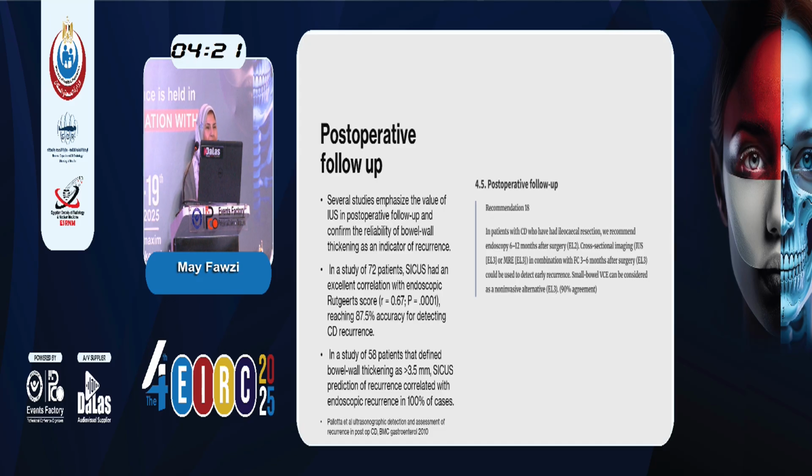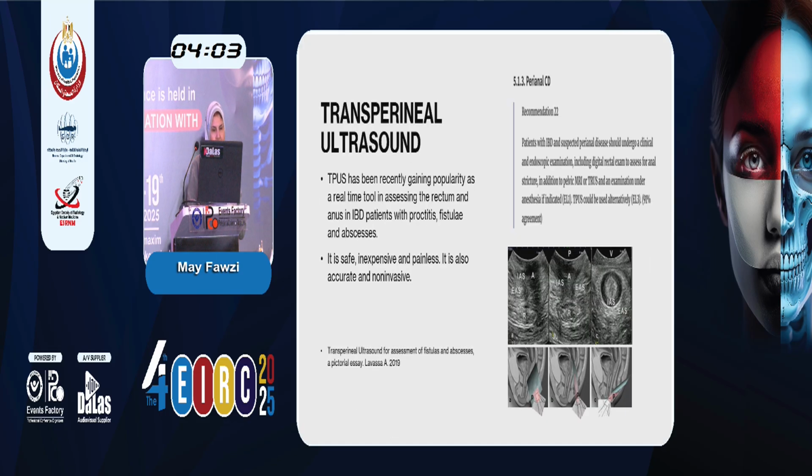Hazard. Okay. Also, IUS is a very good tool for the assessment of post-operative remission or post-operative recurrence, and the recommendations depict that we can monitor in 12 weeks post-operatively for recurrence of the disease.